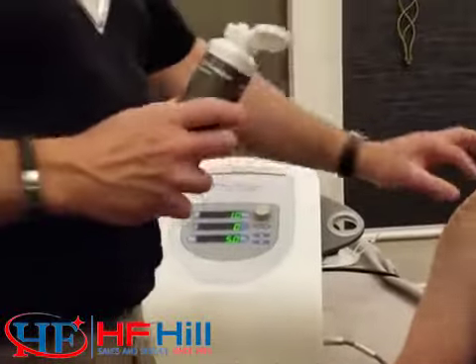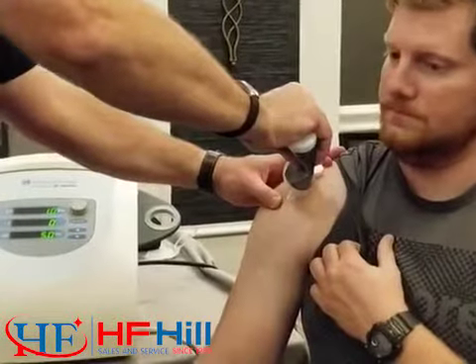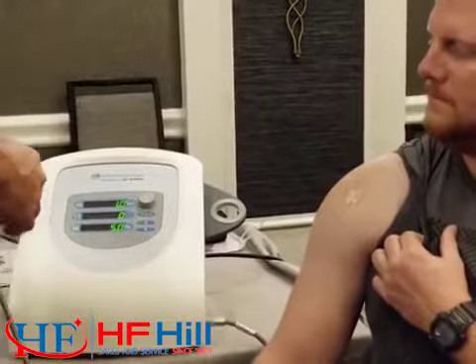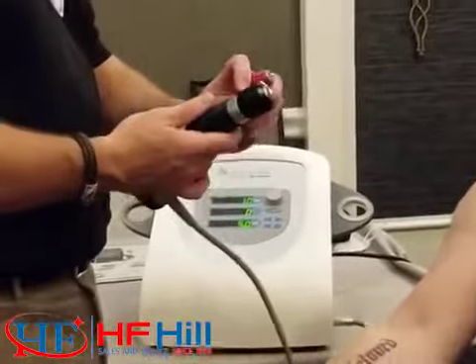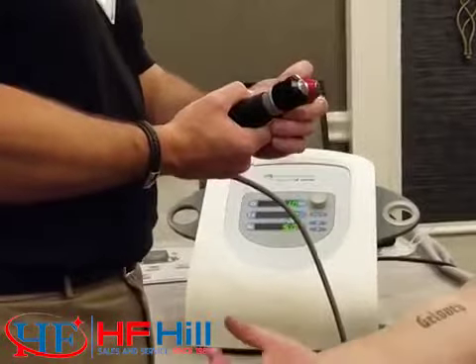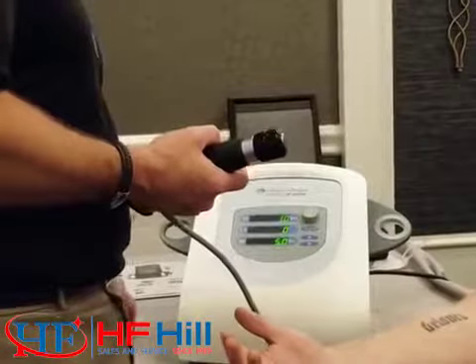Because it's acoustic, we want to use a medium, and we are going to use ultrasound gel. Same process, it's also acoustic. The other thing we're going to think about is which applicator. There are various applicators, and really it depends on what it is that you want to accomplish. If you're close to a bone structure, do you need deeper penetration? Do you need more focus? Or do you need more dispersion?